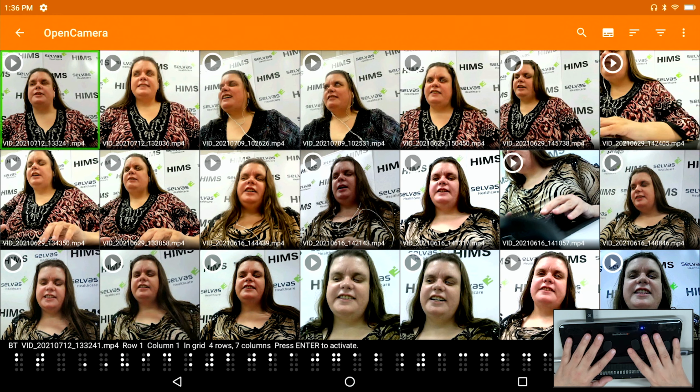And you'll always know that if you play a video for a sighted person from this, that it's very clean. There are no controls to hide. It's automatically in full screen mode. Again, it just doesn't get any easier than that. If you do need to have controls and you want to be able to move through the video, you would want to use another app. But for the most part, when you show a video, you're usually showing it to someone visual. So once again, this is the easiest way to handle that.